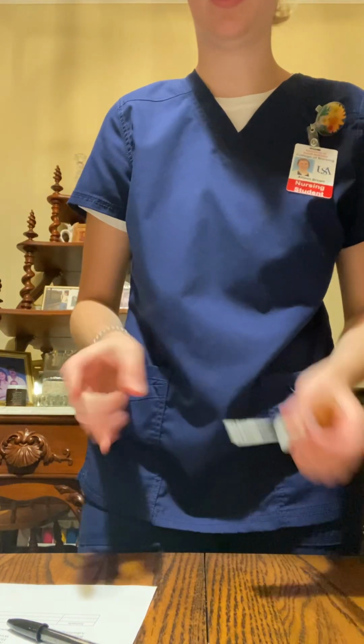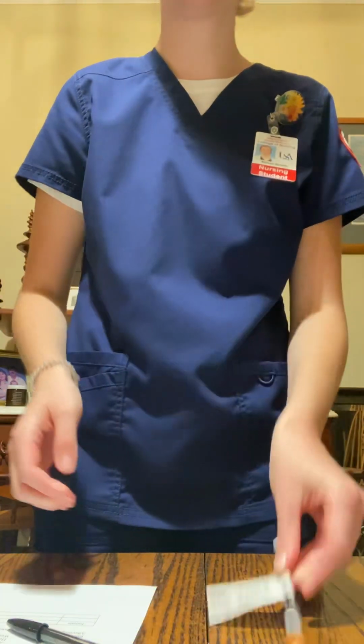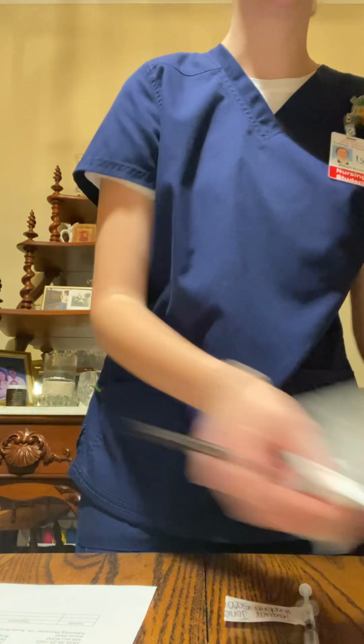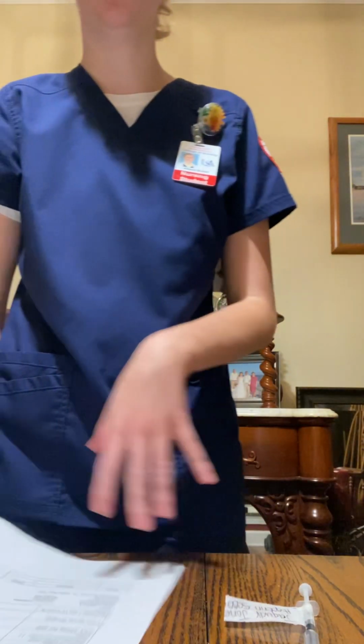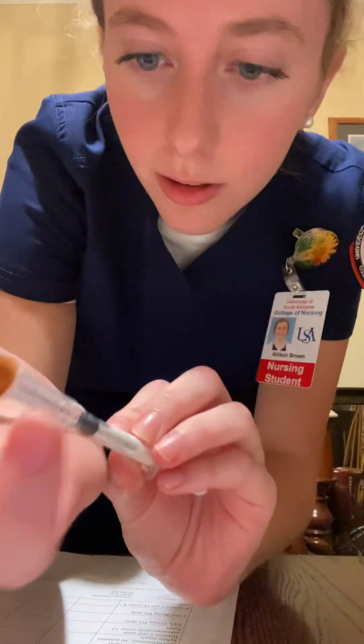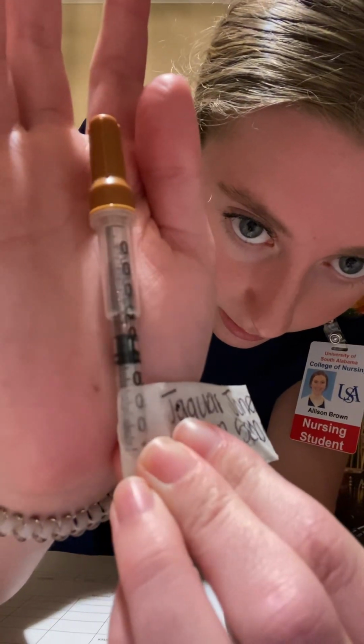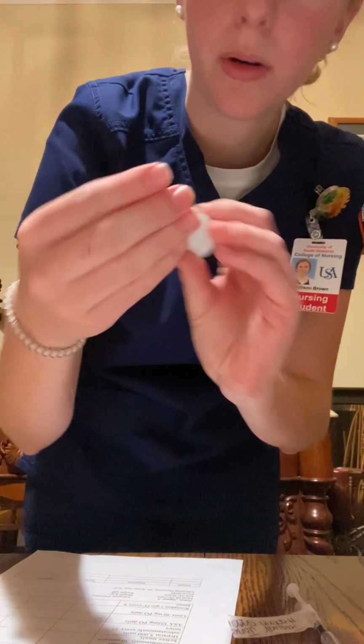And I would use hand hygiene before I drew that up. So now what I'm going to do is go to my patient's room, and with me I'm going to take my syringe with my medication that I drew up. And before I go in there, let me show you that I do have 0.5, and then my heparin vial. So I'm going to take all 3 of these to my patient's room.